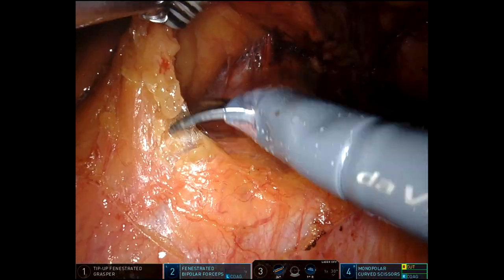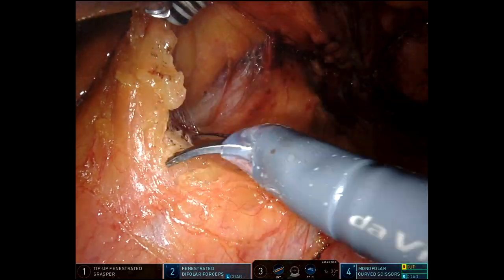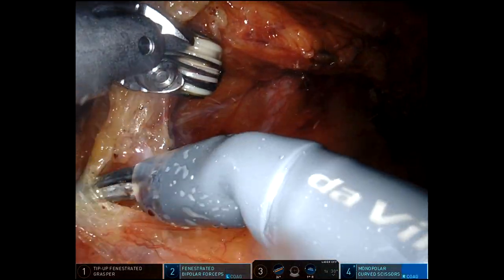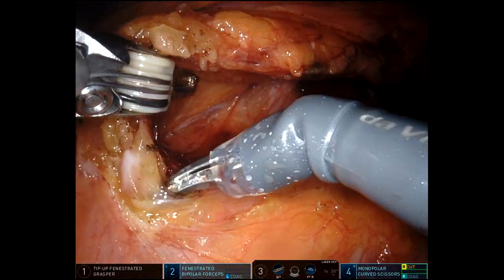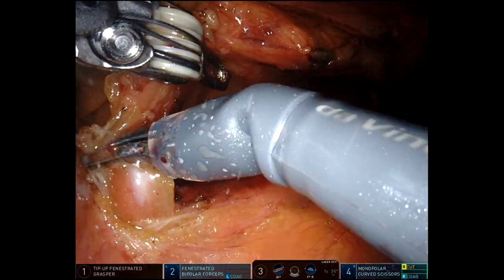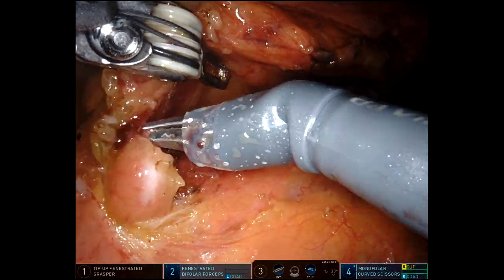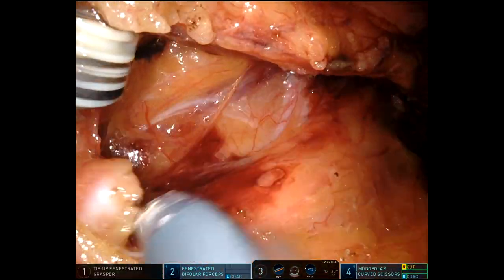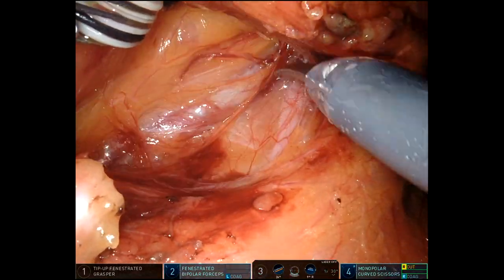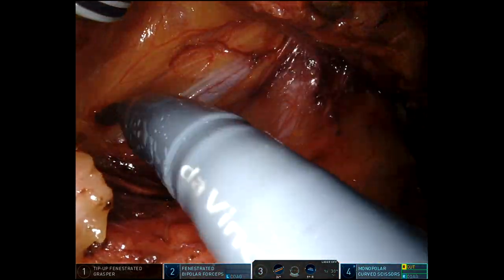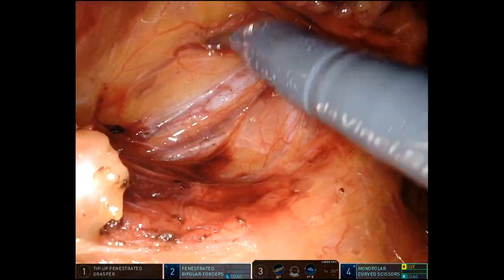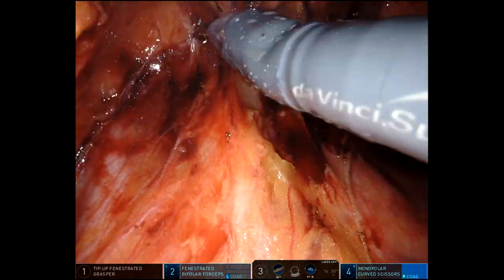Here we're going to start coming out and underneath the superior hemorrhoidal vessel and looking for the ureter. That's just a big inflamed lymph node there, and right there is the ureter. You'll see in a little bit why I really like ICG in the ureters.